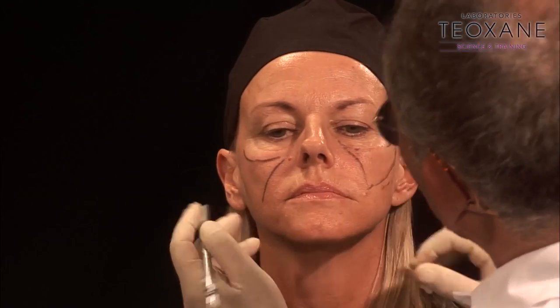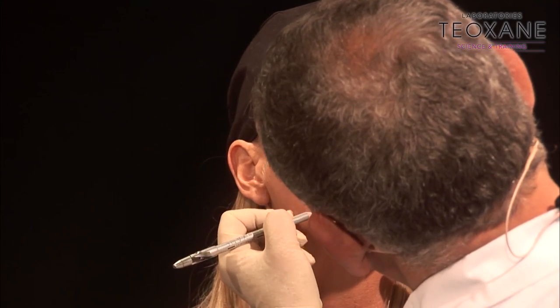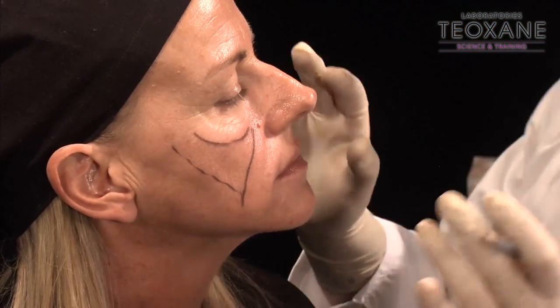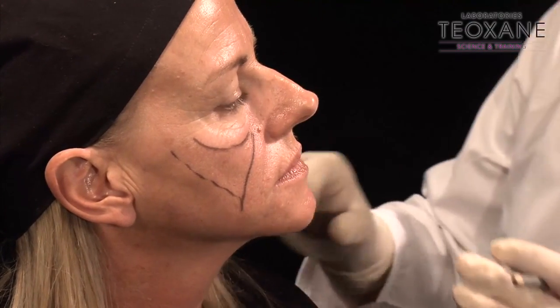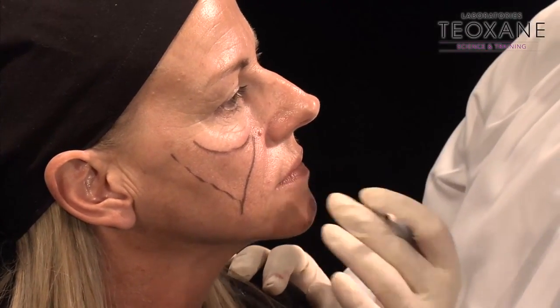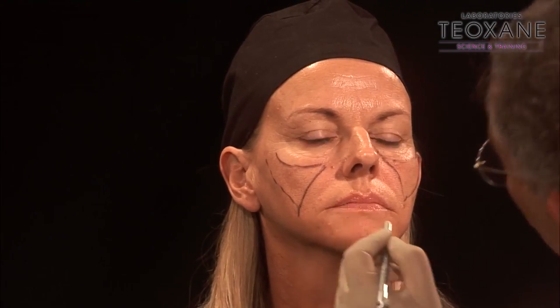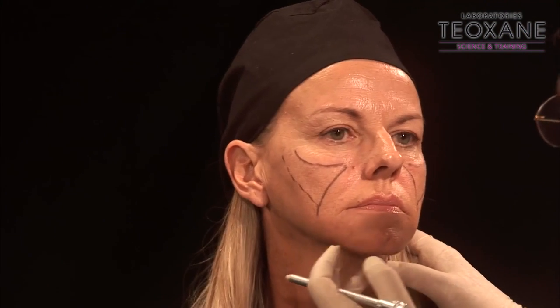We'll work with the fine lines above the lips to introduce you the RHA1. She has lovely lip shape. We're going to improve the lip also. Redefine the contour of the lip more than the volume, because I think she has a nice volume. It's more the definition has been a bit rubbed, and you have all these fine lines here. I'm going to try to fill, by doing the outline, the contour of the lip.